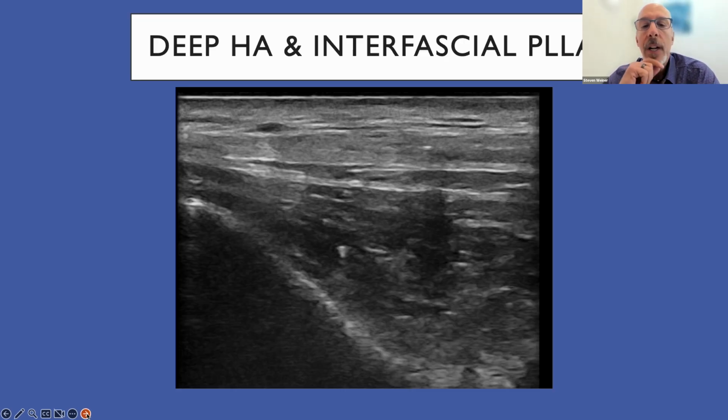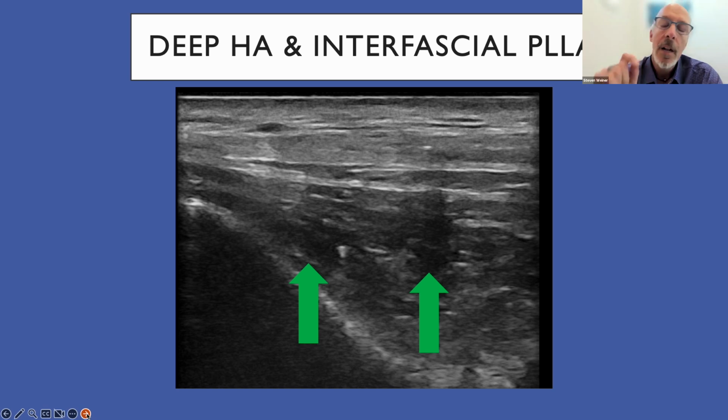So I want to show you what it looks like after filler. And this was a demonstration patient, and they got injected with HA filler, needle down into the bone in 2 different areas, one here and one there. And take a look, the filler does not stay on the bone. This is because there's a phenomenon called backflow, and I'm going to show you that a little later, where the filler goes the path of least resistance after you start injecting. And the path of least resistance is back up the needle or the cannula.